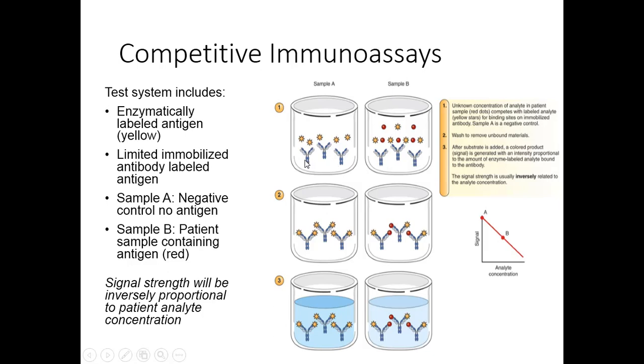Capture antibody is immobilized to the solid surface of our test wells. It's usually some kind of a test well that we're doing this in, but we're going to immobilize the antibody. Why do we immobilize it? Number one, because we don't want to wash it away, right?